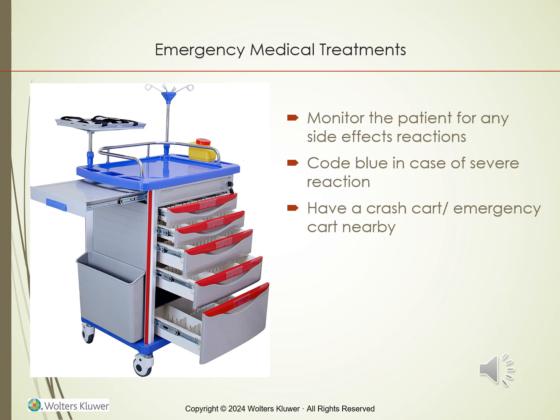Essential items include defibrillator, suction devices, bag valve masks, common medications, along with drugs for intubation, and supplies for venous access. That's why it's always important after you inject the patient to keep an IV line in them. That way you can respond quicker with the necessary medications if you need to, and they already have IV access.